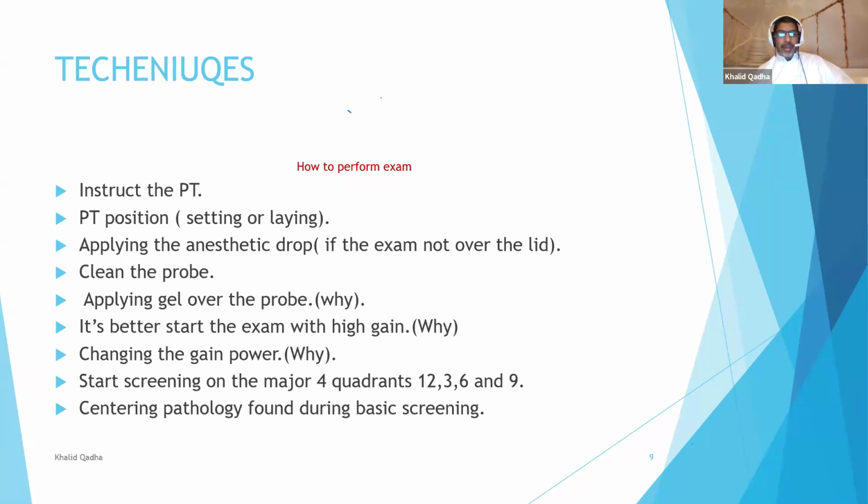Clean the probe. This is the most important thing before putting the probe on the eye of the patient. Cleaning the probe is number one. Once you start your machine in the morning, you need to clean it. Once you finish with the patient, directly clean the probe, because when you use the gel, it will stay on it and will form some crust. Why are we using the gel? We are creating a media between the probe and the eye, allowing the sound waves to go through it and give you a better picture.